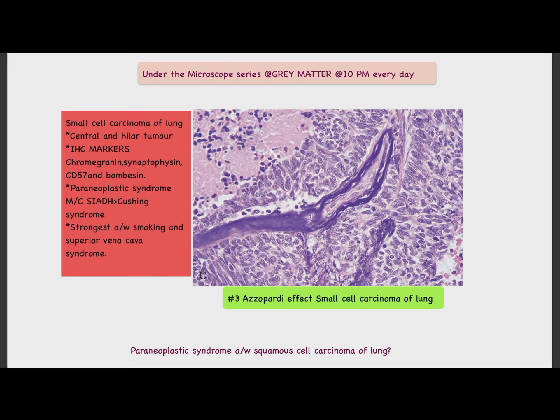In today's video, under the microscope series at Gray Matter, we are going to discuss the Azzopardi effect, which is characteristic of small cell carcinoma of the lung. The Azzopardi effect is basophilic staining of the vascular walls — this is the blood vessel — due to leaked out delicate nuclear material.